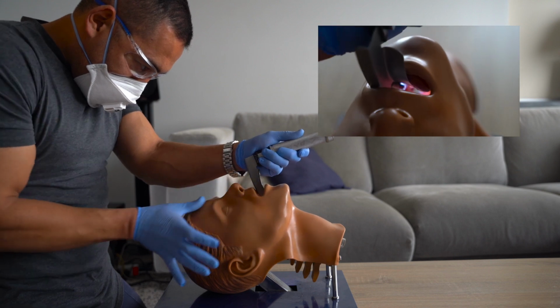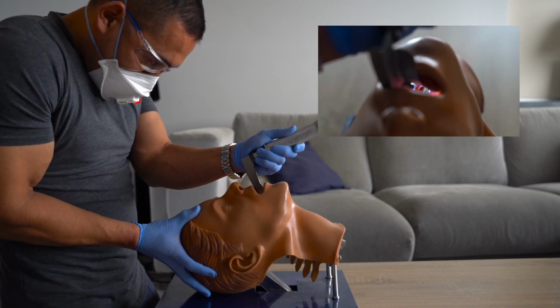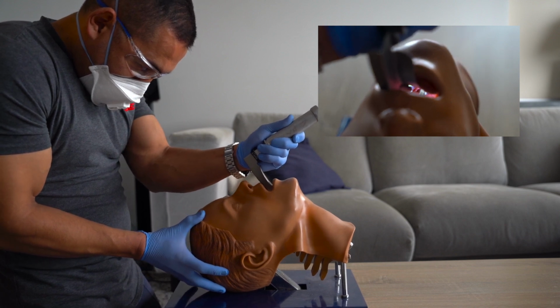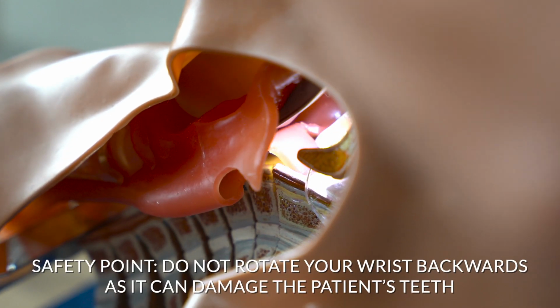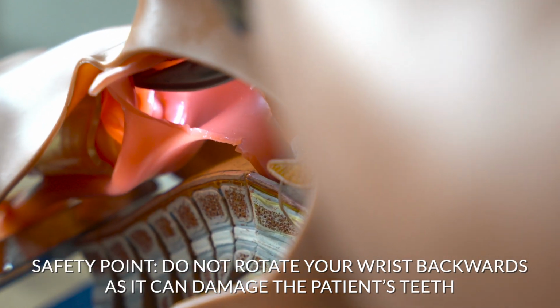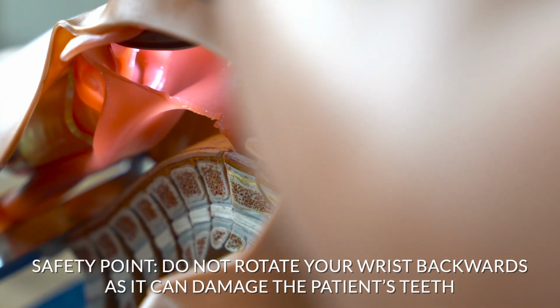The next important step is to position the tip of the blade in the vallecula. Upon achieving this, you can begin to lift your left arm. To do this, keep your left arm rigid and your elbow tucked in, as this will maximize mechanical strength. Lift forward and upwards along the line of the handle to indirectly elevate the epiglottis and expose the glottis. The first glottic structures seen are the posterior cartilages, namely the arytenoids. Next, you'll see the vocal cords and glottic opening.